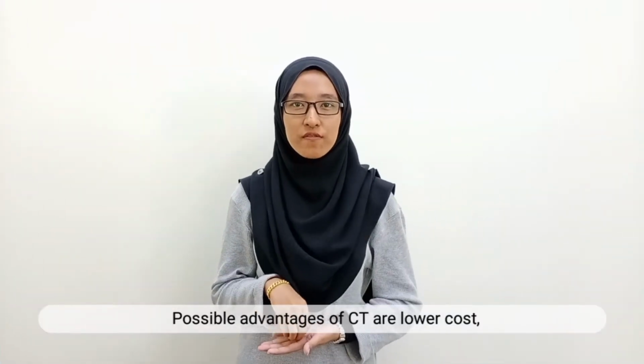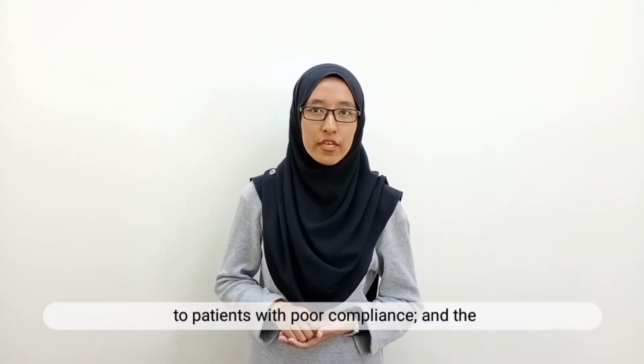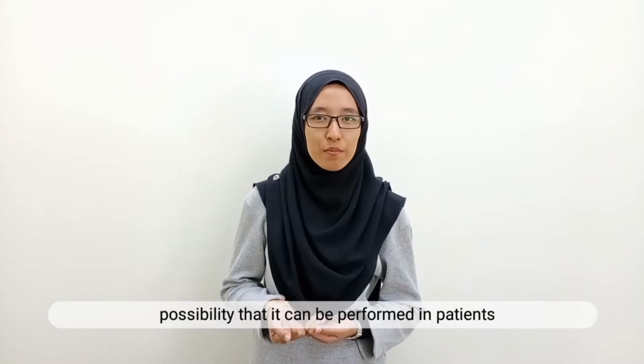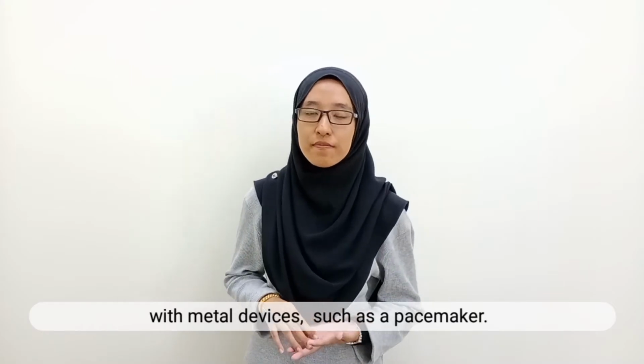Possible advantages of CT are lower cost and shorter acquisition time, making it more adaptable to patients with poor compliance, and the possibility that it can be performed in patients with metal devices such as a pacemaker.